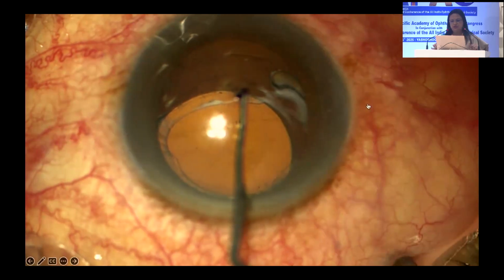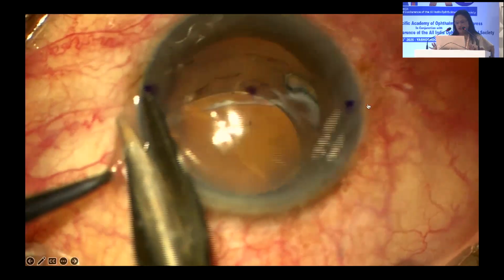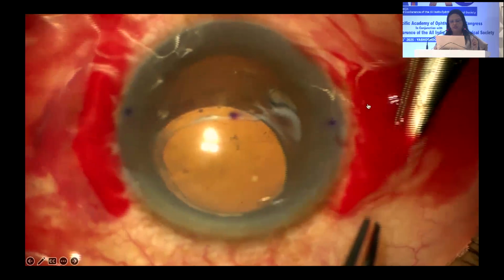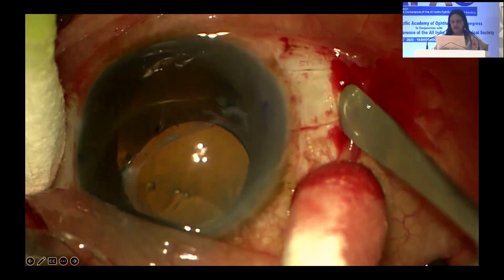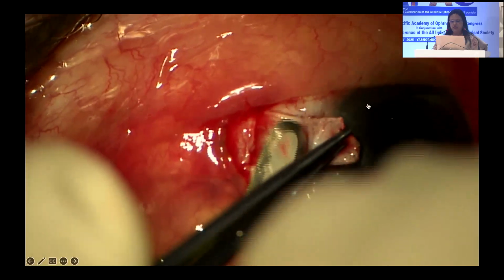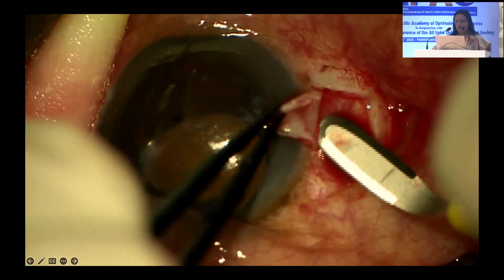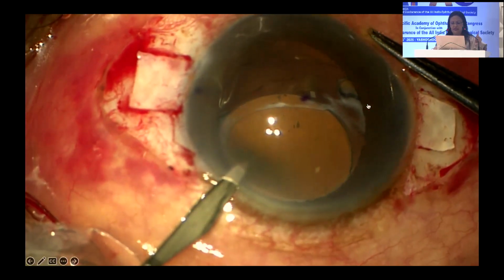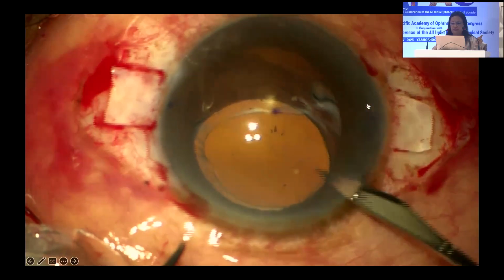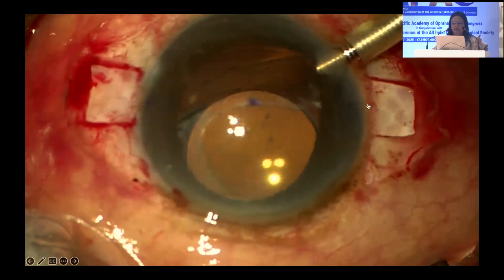The last case I'm going to show you is where I have used a slightly different technique. I did start with doing a glued IOL, but then I decided let me use a Gore-Tex suture to reposition the lens, because this patient also has a single piece lens. A single piece lens you can't glue, so you'll have to remove it and then replace it with another IOL. So in this case, I decided to do a Gore-Tex suture fixation, because that is much stronger than 10-0 polypropylene, which can erode over a period of time and again cause dislocation. Gore-Tex sutures are being used widely now for this type of procedure.